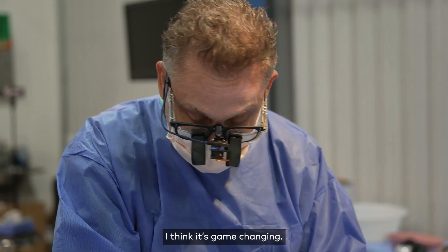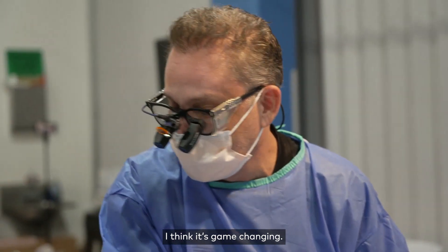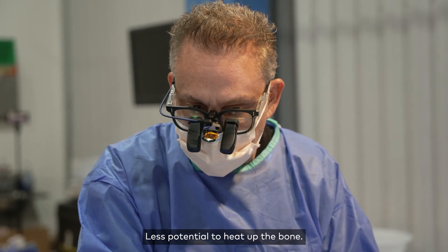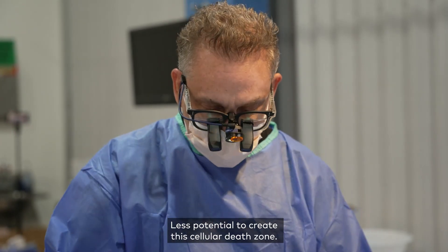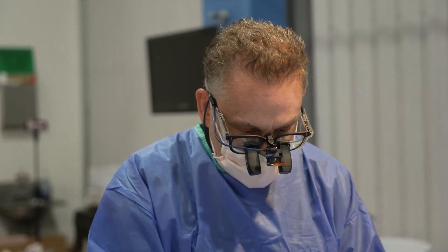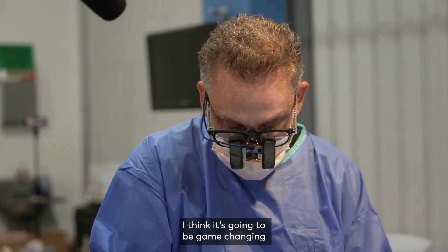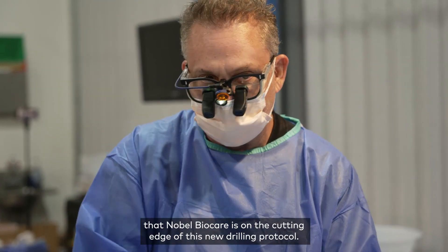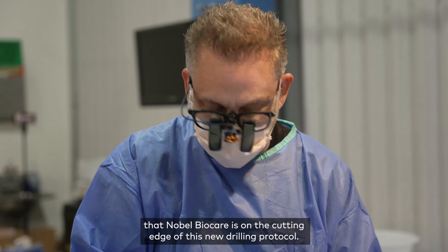I think it's game changing — fewer burrs, less potential to heat up the bone, less potential to create this cellular death zone. I think it's just going to be game changing, and it doesn't surprise me that Nobel is on the cutting edge of this new drilling protocol. Very impressive.